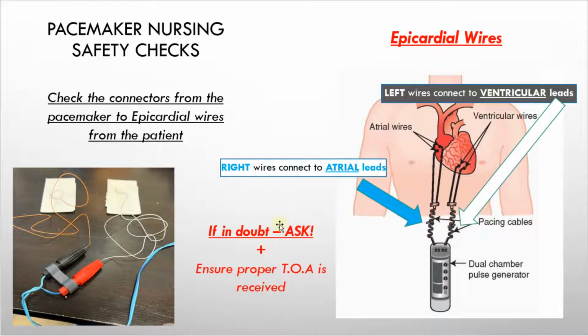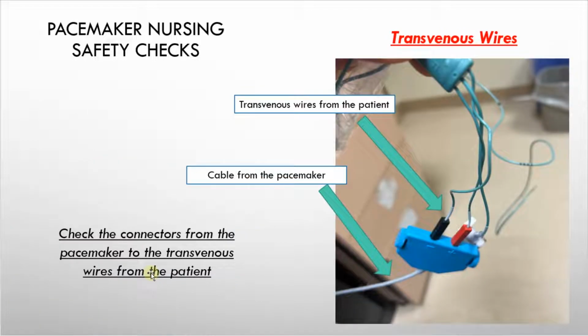Okay, if in doubt, always ask, and make sure that when you give report or take reports, that is part of your transfer of accountability as part of the report process. And this picture here just shows how the epicardial wires look. They're very, very thin, and they connect to wires like this. Okay.